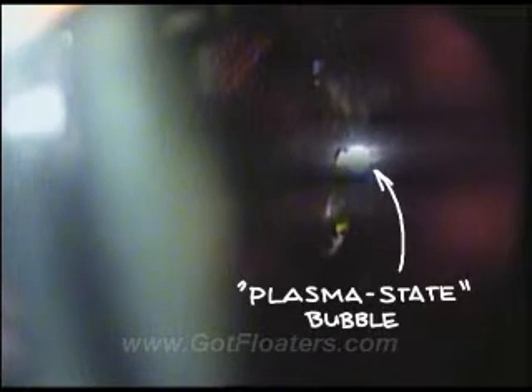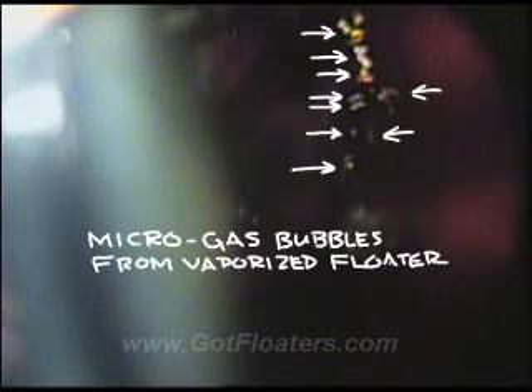Again, large bursts of bubbles — the material itself is breaking up. This patient did very well after one treatment. There's a freeze frame of the plasma bubble that's formed, a bright spot that happened to be caught. These are a cluster of micro-gas bubbles from that area floating up and out of the way. This patient did particularly well; the battleship cruiser that he saw is now gone after one treatment.